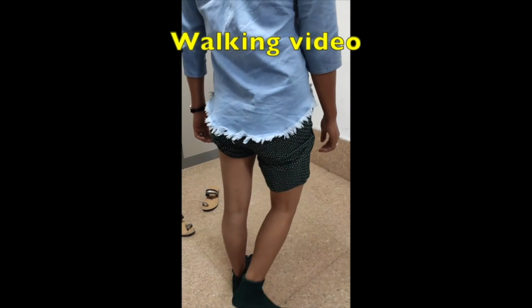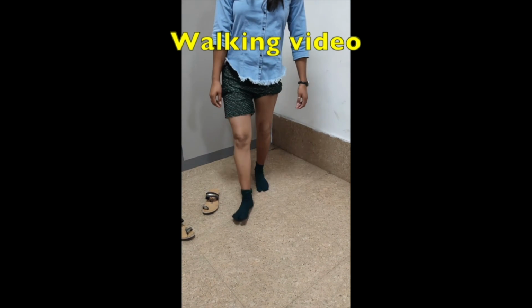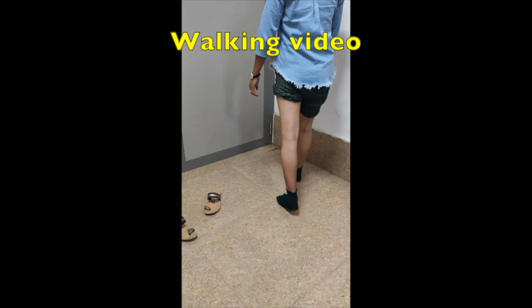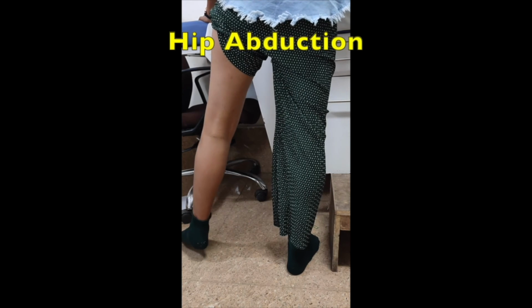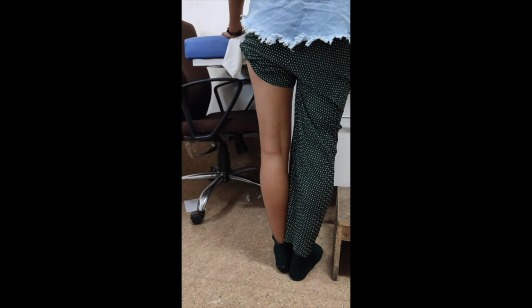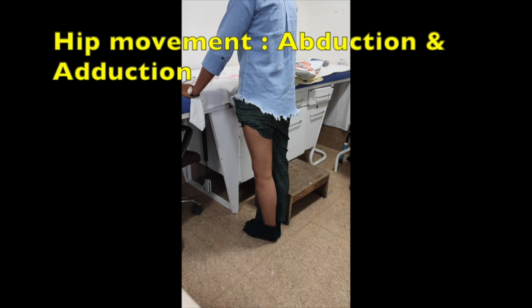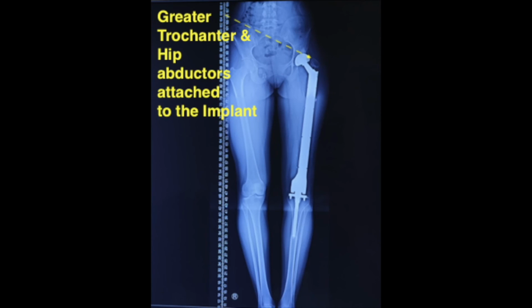Sciatic nerve was preserved. And this is the walking video of the patient, and patient is able to walk without any support. There is a limp and slight lurch during the walking because muscles around the hip joint were resected. This was the patient's hip abduction and adduction, and patient is able to do a good amount of abduction adduction movement despite replacement of the total femur, because the greater trochanter and hip abductors were attached to the implant.